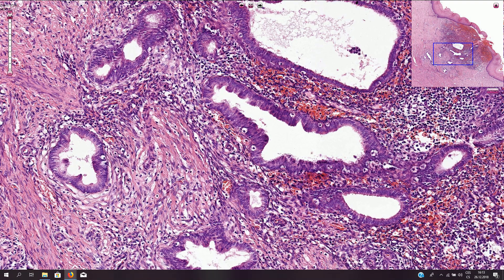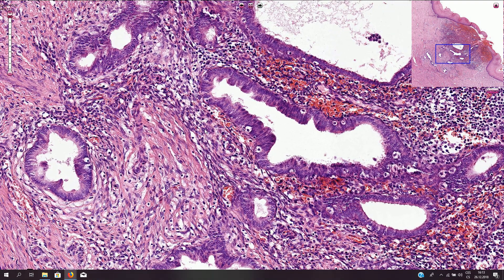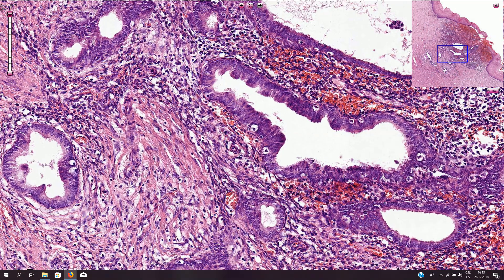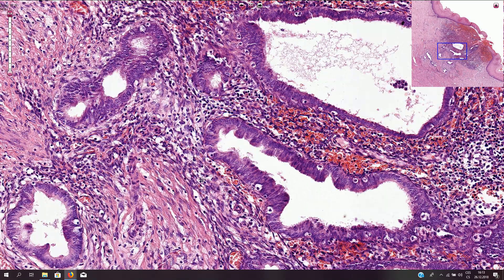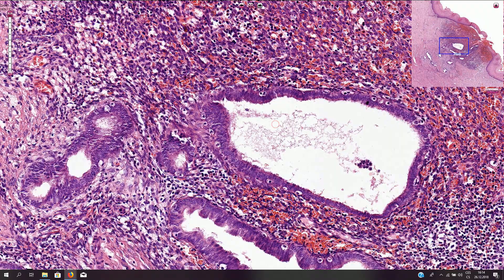Around the glands there is endometrial stroma, which is slightly denser and composed of spindle-shaped cells which are closely packed, and here we also see lymphocytic infiltration. If you want to make sure that this is endometrial stroma, we can use immunohistochemistry — these cells would be positive for CD10.